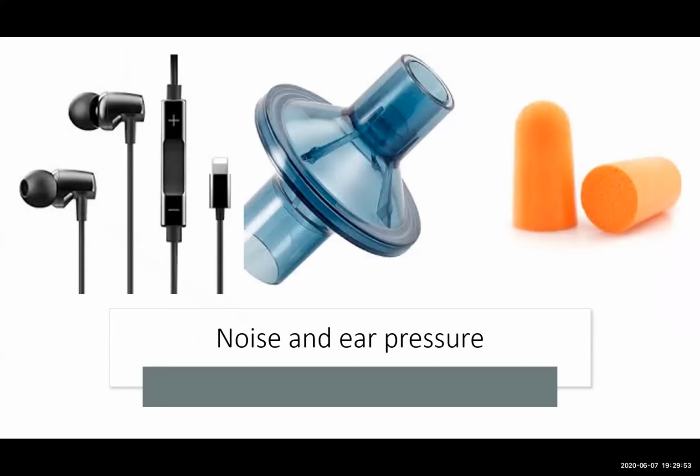Ear pressure, which I mentioned earlier, that resembles the pressure that you feel when you're in a plane, is a common complaint. Some patients who describe severe pressurization issues during flight sometimes cannot tolerate the helmet. Some centers have chosen to provide the patient with ear plugs, and some ask them to just apply their earphones and run some music while the helmet ventilation is going on.